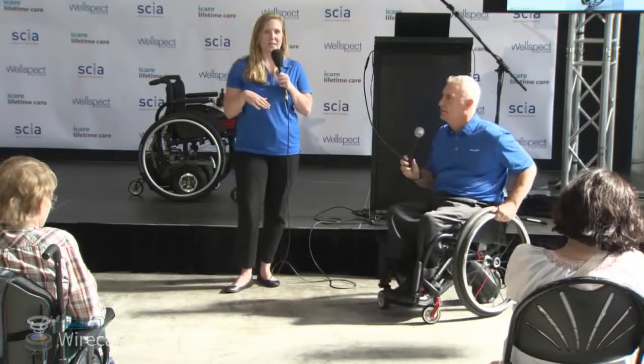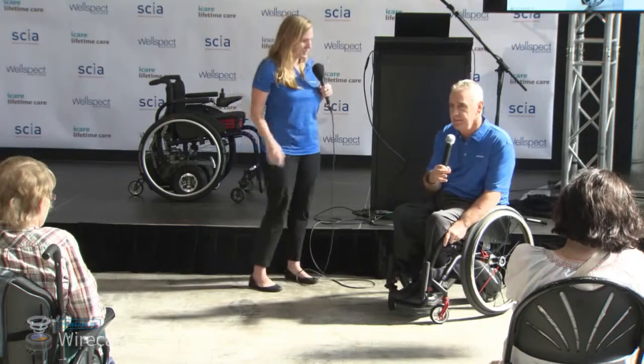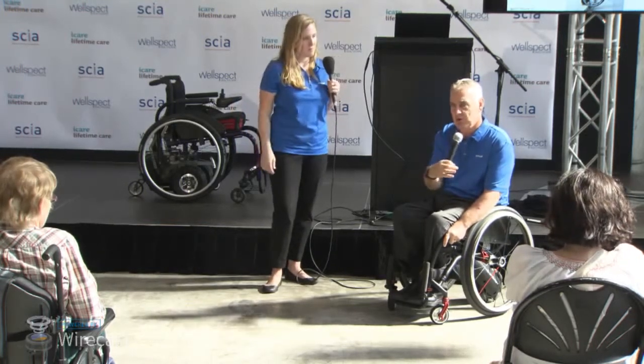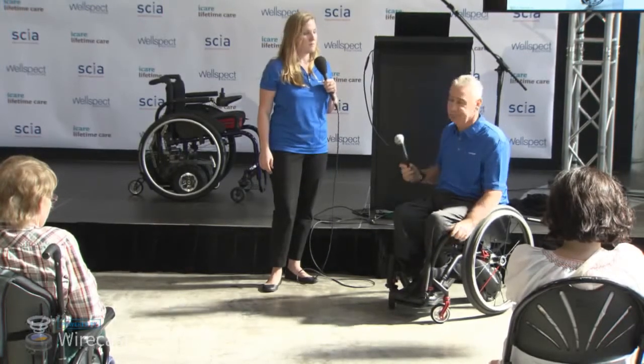Maggie talked about the setup of your chair — really important. One of the things I find with this is that even though it adds a bit of weight, when my chair is set up properly, I don't actually notice it when it's on.